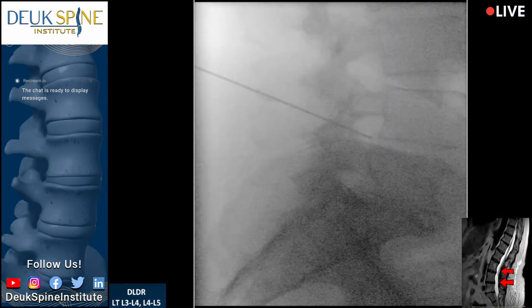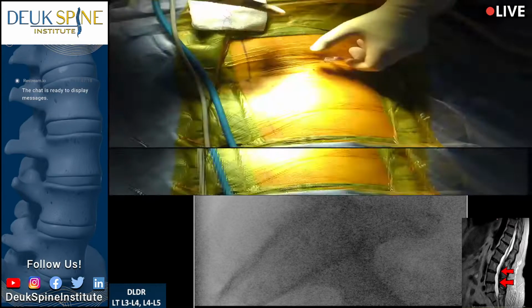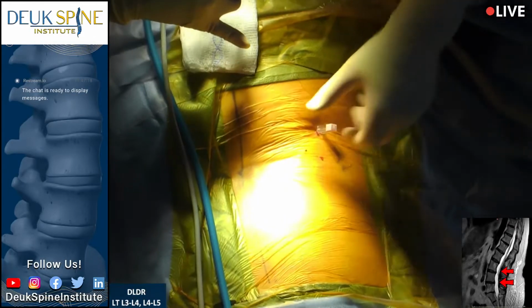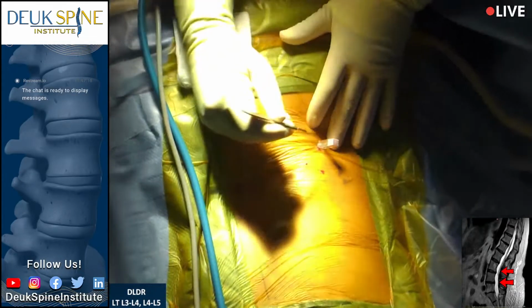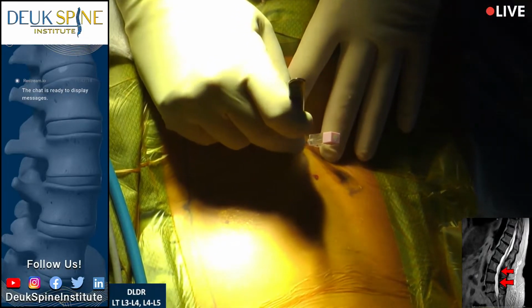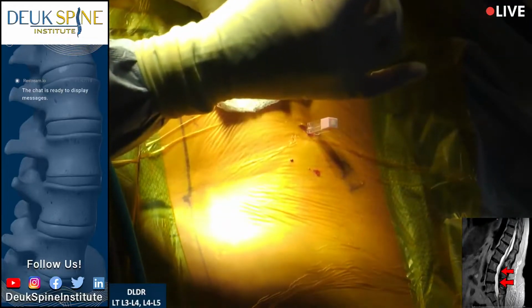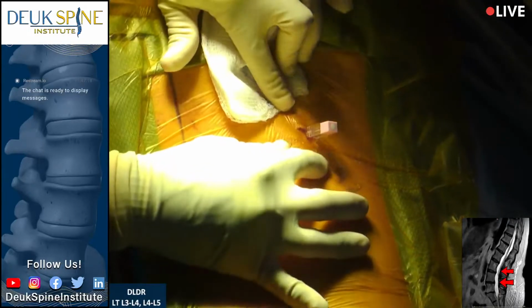All right, we're right up against the herniation. Once again, I can feel it. We're going in. We are inside the L4-5 disc with the needle. So it's perfect. We went through the tear and the herniation. You can't do better than that, folks. See, other surgeons have to tear out your spine in order to get down to the herniation. But we're not doing that. We're doing it all through a natural hole that's already there.